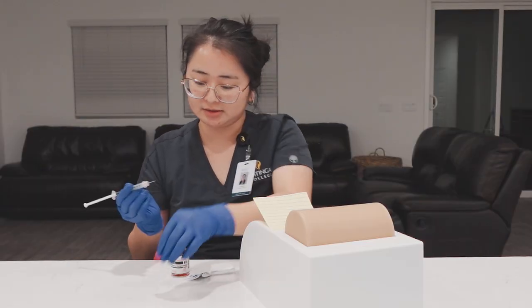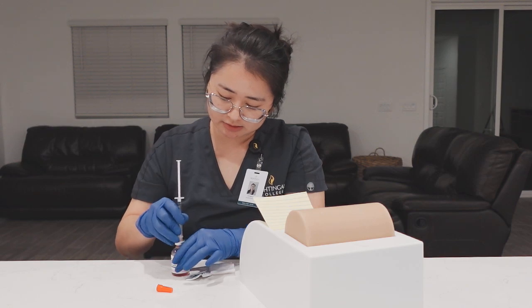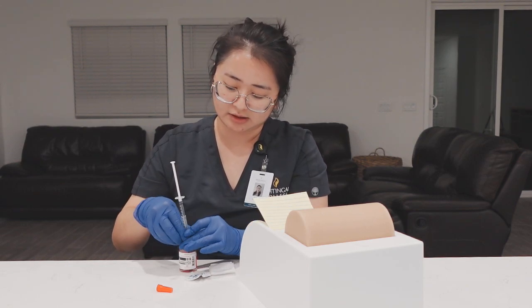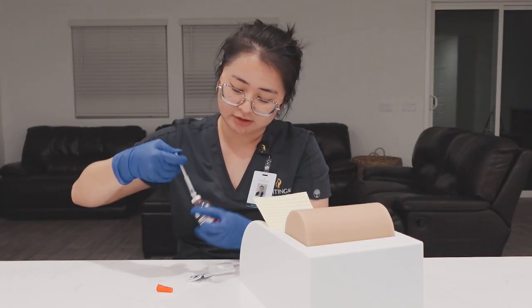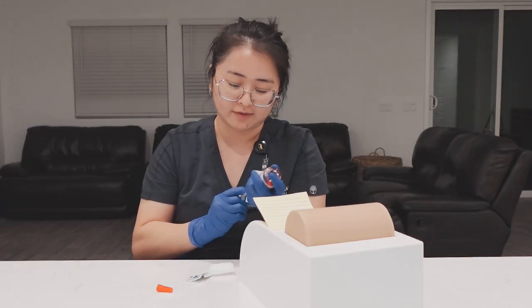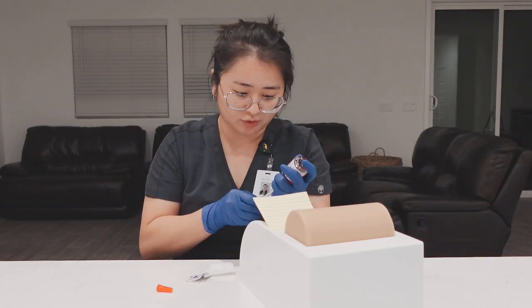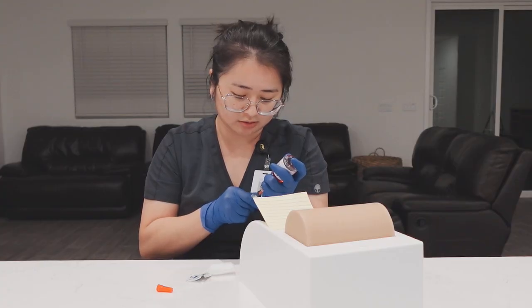So I'm going to uncap this. I'm going to insert this, and we're going to then administer the air. Administer the air, and then we're going to invert the vial. Then we're going to draw the medication. We're going to draw 1 milliliter.